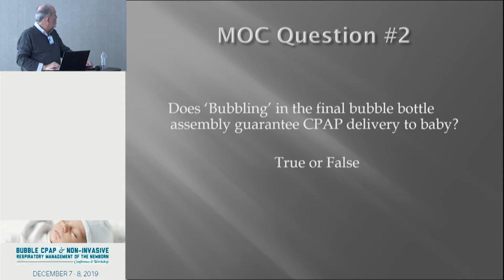Does bubbling in the final bubble bottle assembly guarantee that CPAP is being transmitted to your baby? True or false? If it's bubbling, my baby's getting CPAP. No. The airways are closed or the prongs are closed. It will bubble. It will bubble. Baby's not getting nada. What's the best way to know whether your baby's getting something or not? Get your ears out and listen, because you can hear that transmitted, okay? And you should always be listening to make sure that your baby is getting what you think they're getting, especially if they start to take that turn, okay?